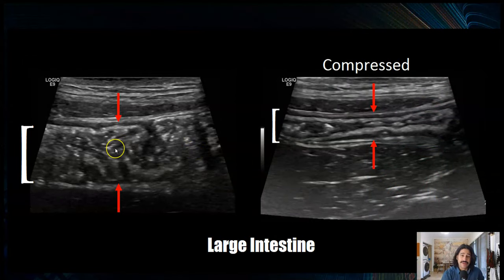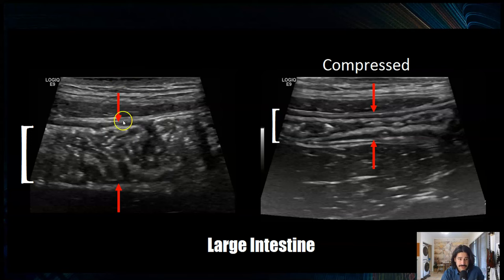Bowel that's not filled with dense feces is compressible. That's important for the small intestine, large intestine, and especially the appendix. If you can't compress it, it's because it's distended with feces and/or fluid. You can see here a picture of large bowel — you see the haustra, you see the submucosa — and then that's it compressed. A little pressure and you can see it compress.